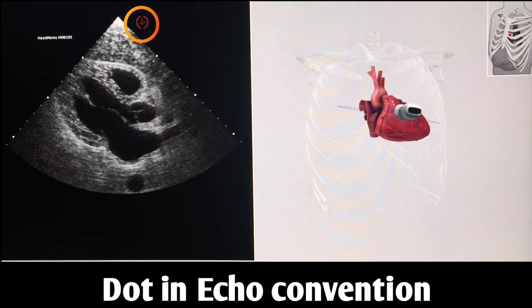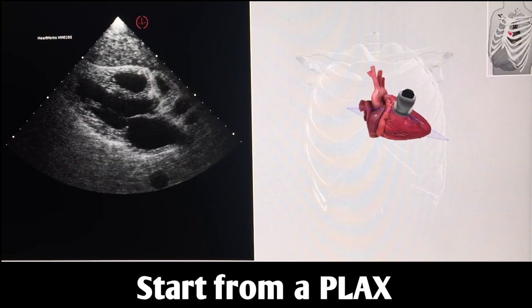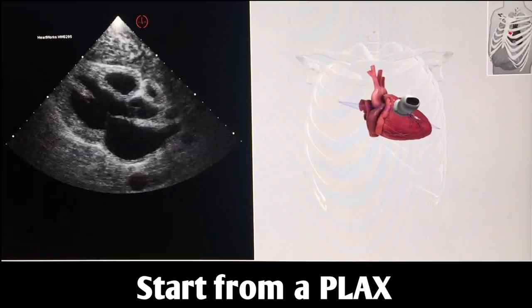First, have the ultrasound machine in cardiac mode. Usually, the indicator will be shown on the right side of the screen. To get into parasternal long-axis view, you will want the probe's indicator pointed towards the patient's right shoulder. If the marker was on the other side of the screen, you would want the probe's indicator pointed towards the patient's left hip. The purpose of this is to give a conventional parasternal long-axis view in which the apex of the heart is facing towards the left side of the screen. The parasternal window is located next to the sternum, between the third and fifth intercostal spaces.